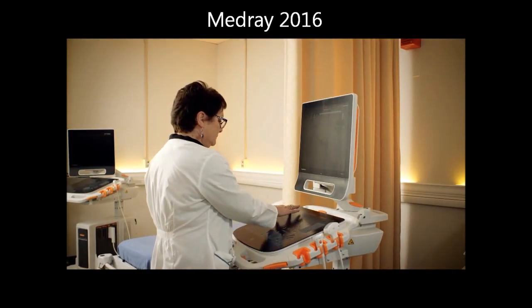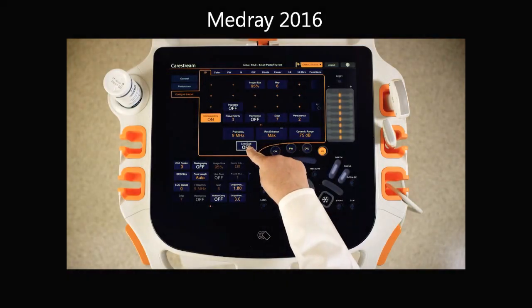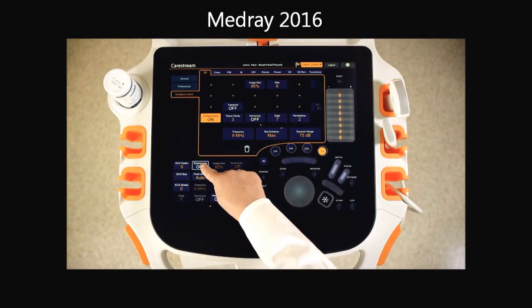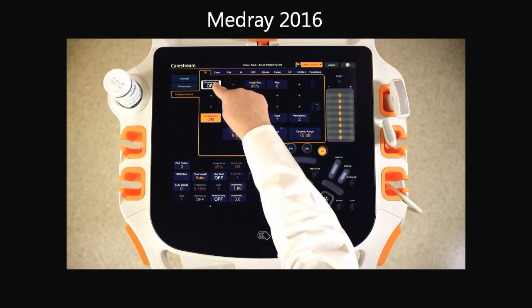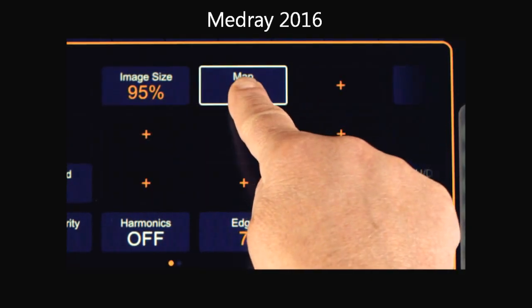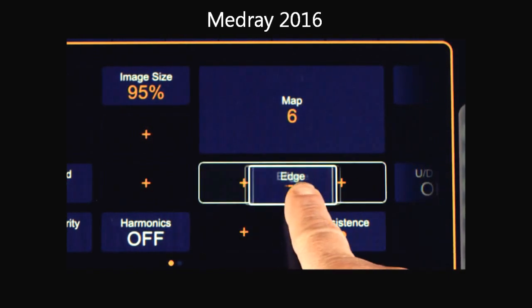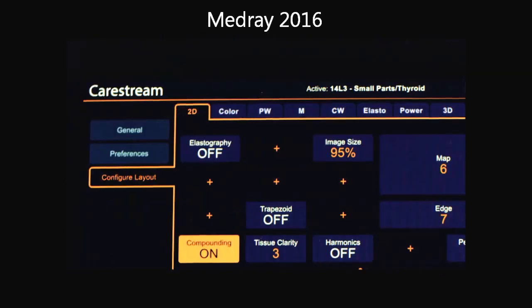By replacing fixed controls with a sleek surface, the TouchPrime Ultrasound System enables you to customize your user interface to make you more efficient, productive, and comfortable. Add your personal touch by loading only the parameters you need, changing the size and backlighting of scanning settings you use most.